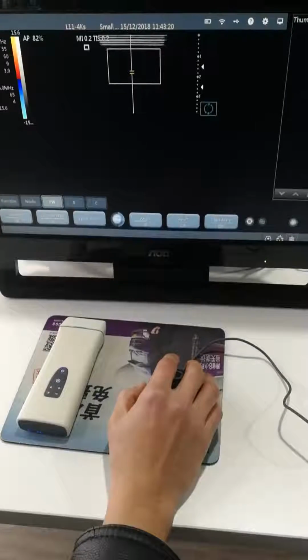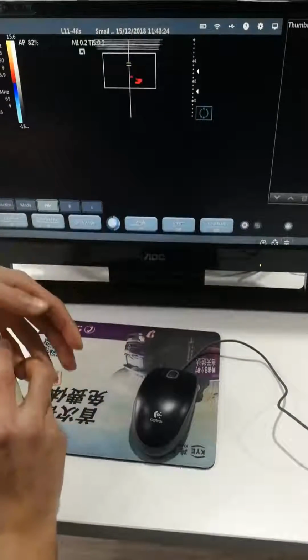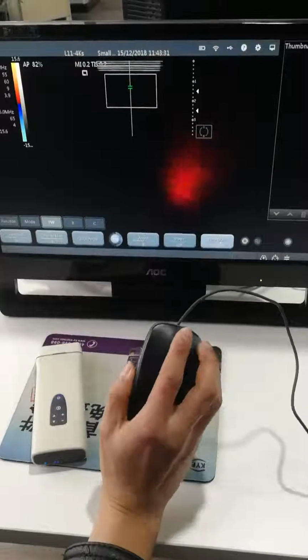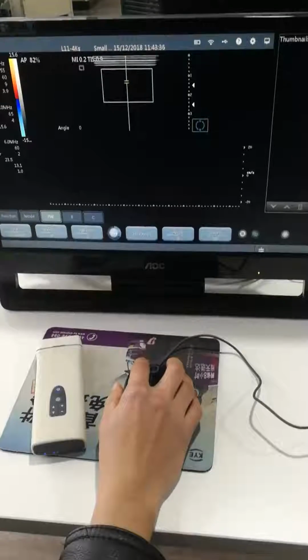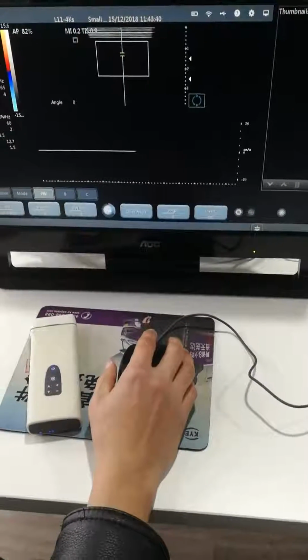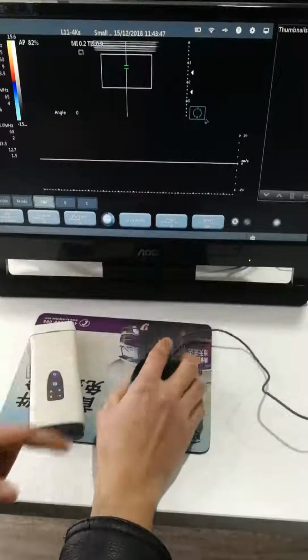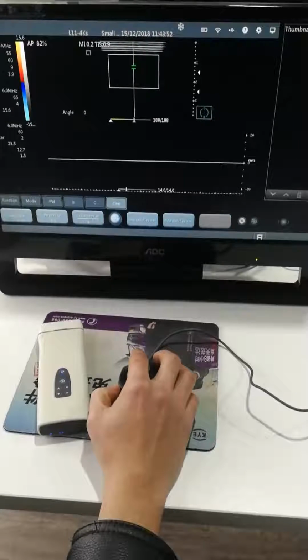SV, and then if you find the vessel and you move here, then you middle click to release the cursor and you click the update. Then it will turn to the spectrum, and when you finish it, you can just go back to the B mode.